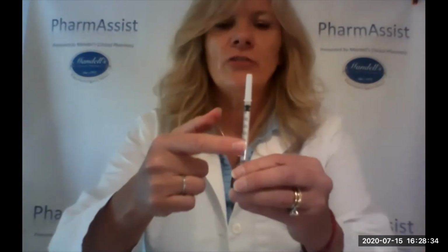And what I'm going to do is let you see that this is calibrated in international units of the drug. So meaning that when your nurse gives you your number, that's what she's referring to, is the number of units for that medication that you're going to draw up. So I'm going to use the example of if I'm drawing up 150, which this is the little 150 line. So what I'm doing is I'm drawing down, and the top of the plunger I'm placing on the 150, and I'm going to inject a little air.